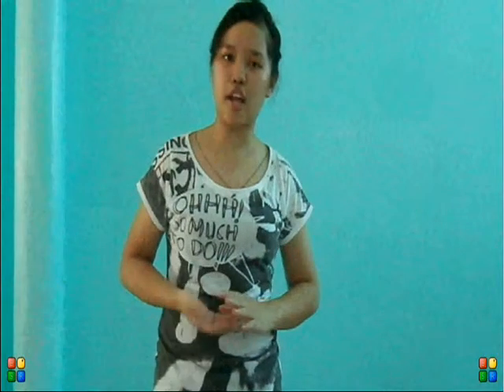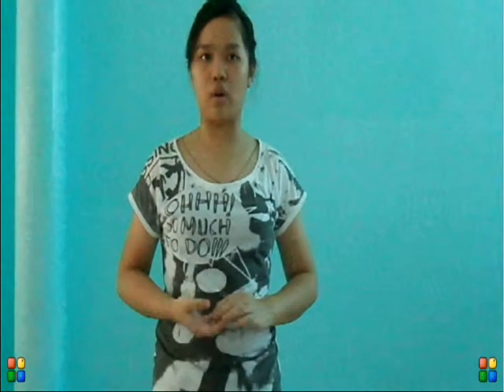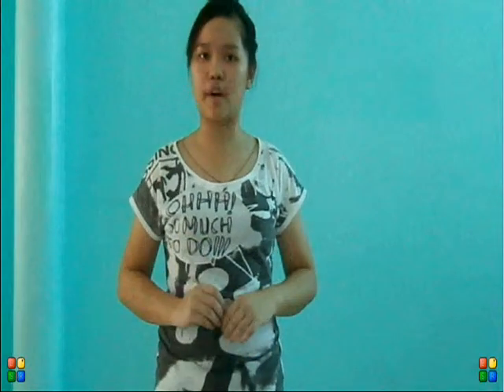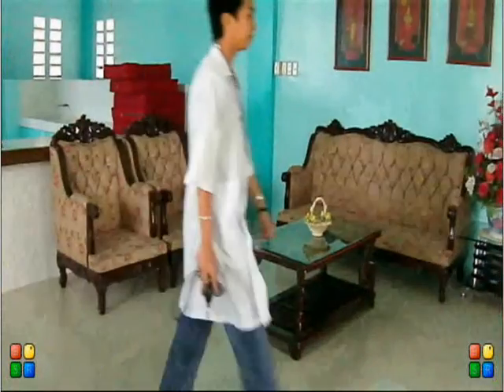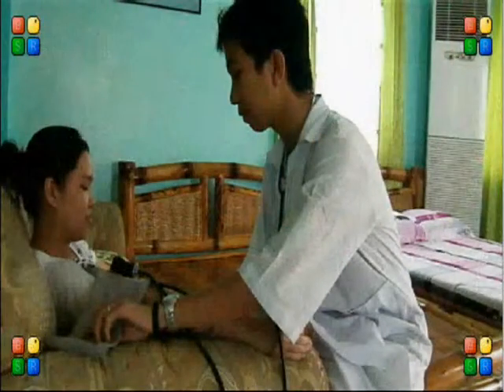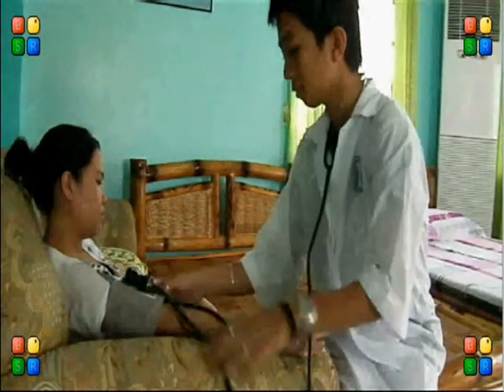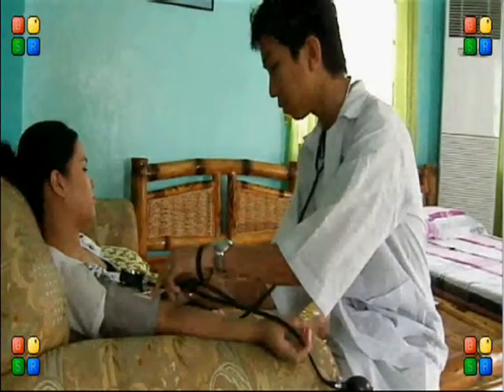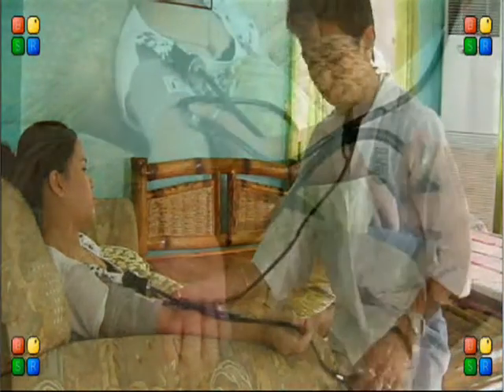Blood pressure is the force that blood exerts against the arterial wall. Liquid flows only from higher to lower pressure. Wrap the blood pressure cuff around the patient's upper arm and place the bell of the stethoscope on the inside of the elbow where the pulse can be felt.